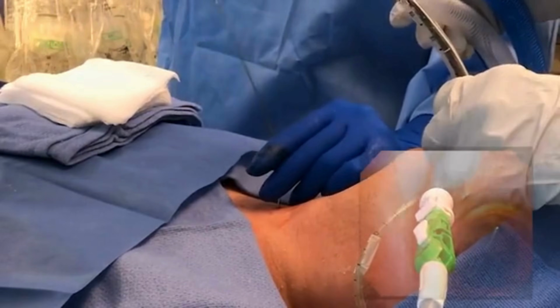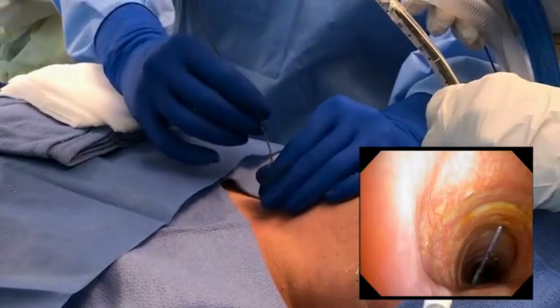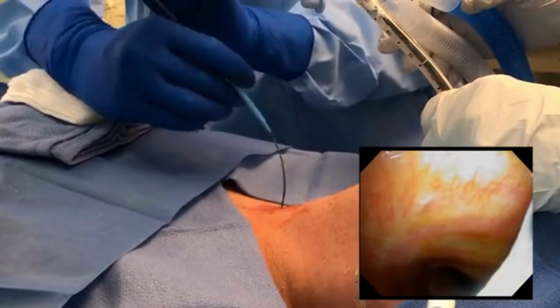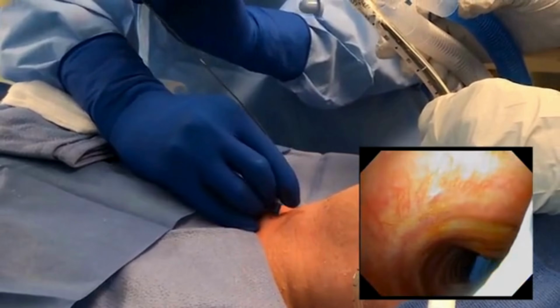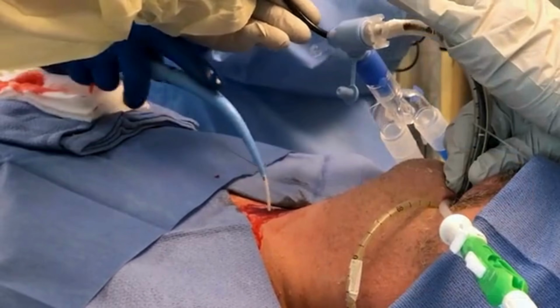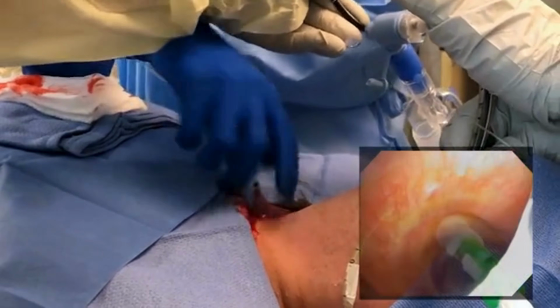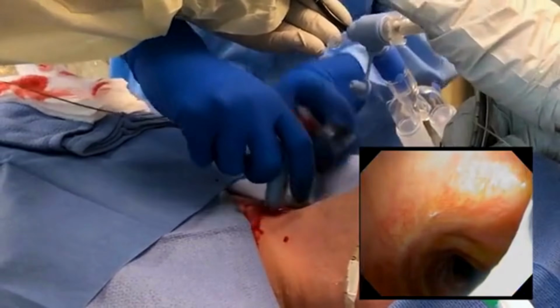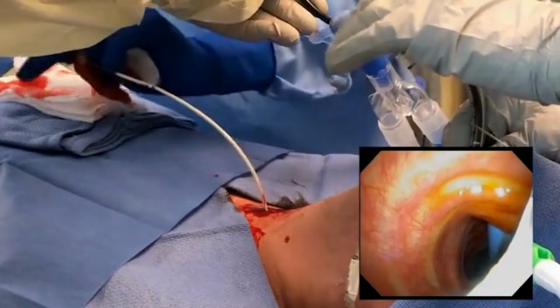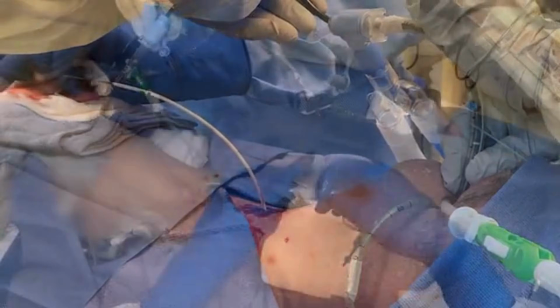Feed the guide wire through the needle and visualize it while advancing it distally toward the carina. Remove the needle over the wire, keeping the wire in the trachea. Advance a small tracheal dilator over the wire to dilate the tract. Remove the small dilator and advance a single-stage progressive dilator over the wire with the protective sheath loaded. Remove the progressive dilator, keeping the wire and sheath in place.